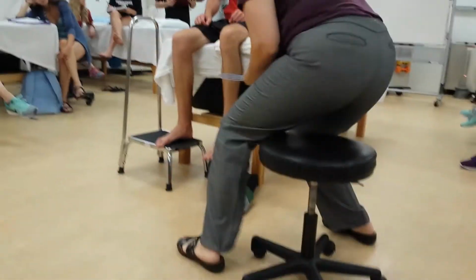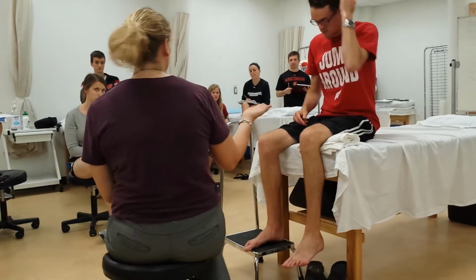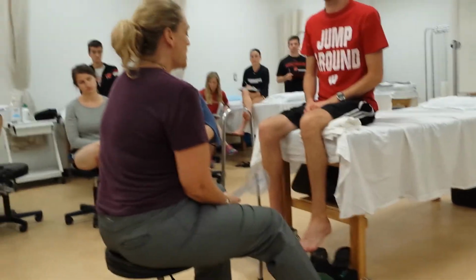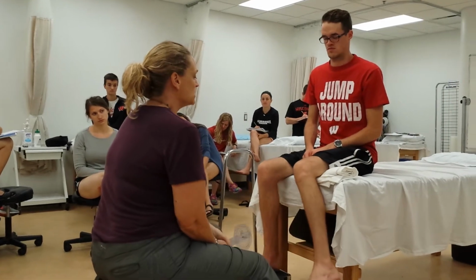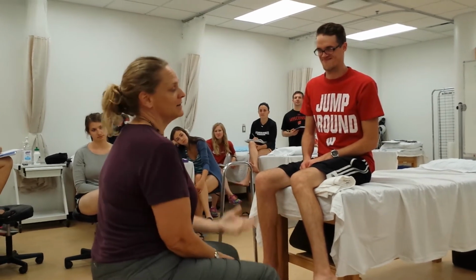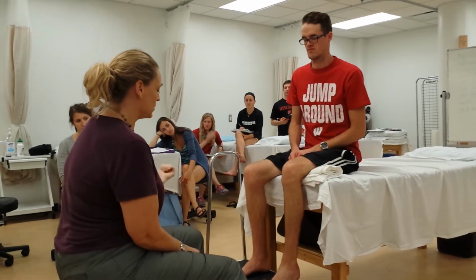Just like when we measured shoulder rotation, we had the person at 90 degrees of abduction, and then we measured along the axis. We're going to do the same thing for hip rotations. So you want to make sure that the hip is at 90 and the knee is at 90. Now, if Scott brings his ankle out, is he medially rotating or laterally? Oh, you are limited. I knew we'd find something. Is he medially rotated or laterally rotated, or internally or externally rotated? Medially. Okay, he's medially rotated. And how about if he brings his foot in?